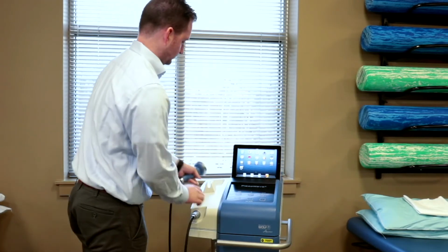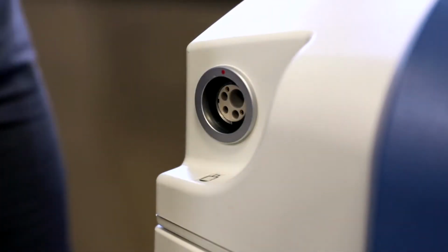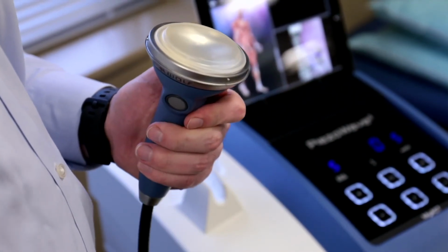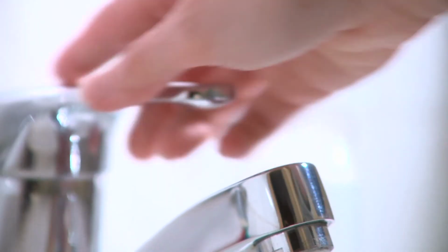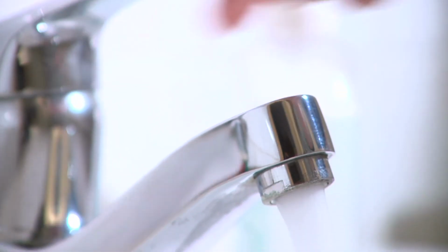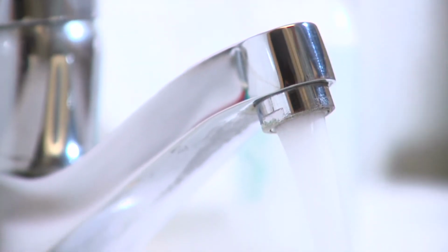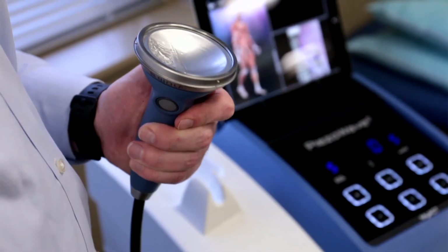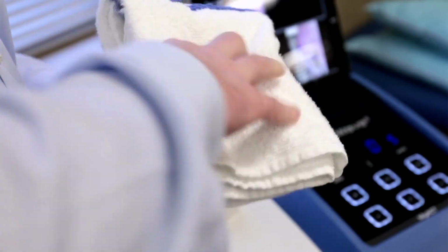For cleaning, turn the control unit off and disconnect the therapy source. Remove the gel pad from the therapy source by turning the twist lock ring counterclockwise. Clean the contact surface of the therapy source, the gel pad, and the twist lock ring in lukewarm water under the faucet. Then wipe with a soft cloth and surface disinfectant.